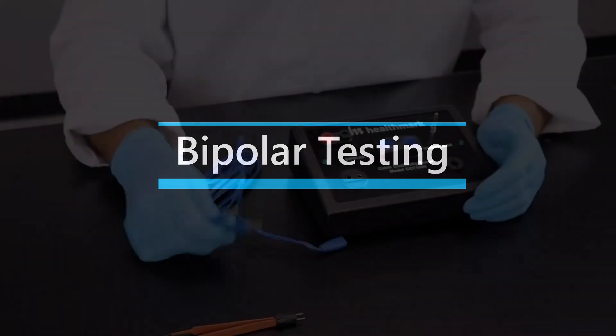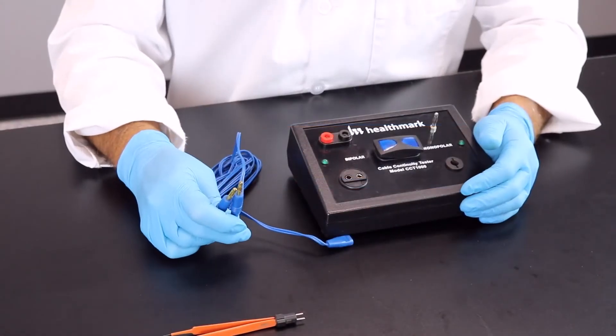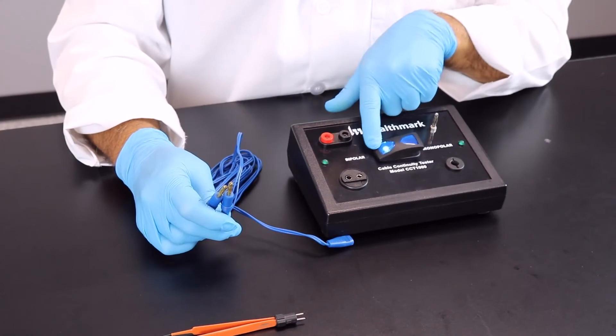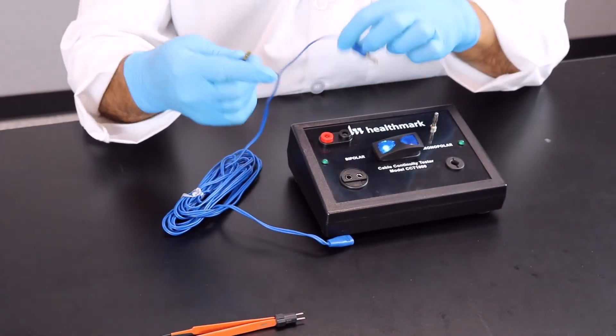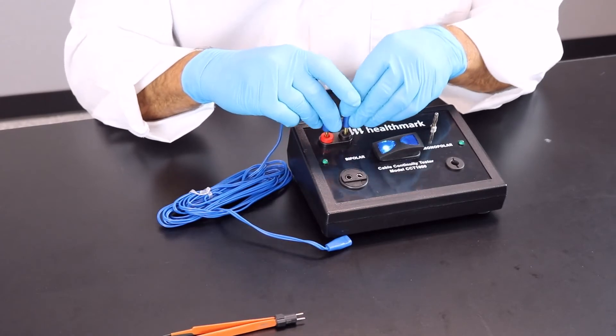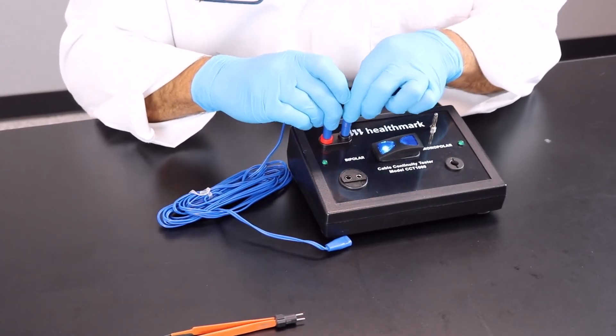So now we're going to show you how to test a bipolar cable. You're going to turn the toggle switch on to the bipolar wording there. You're going to hook up to the red and black and it doesn't matter which one that you put into the port.